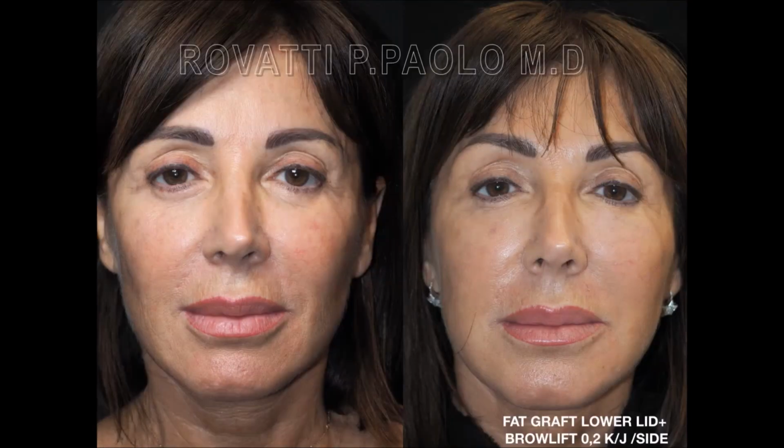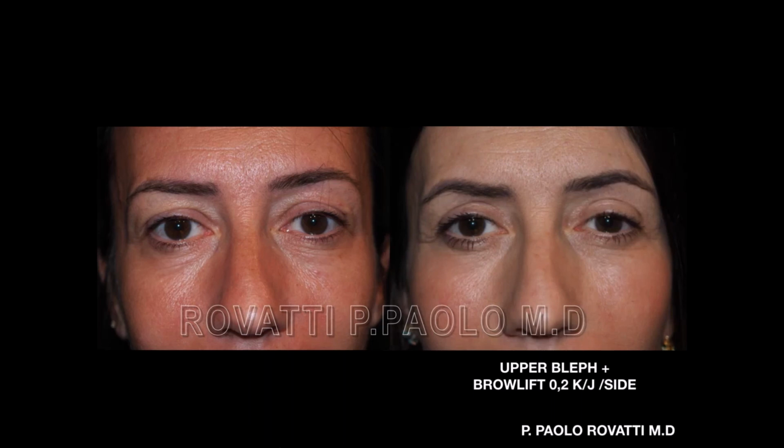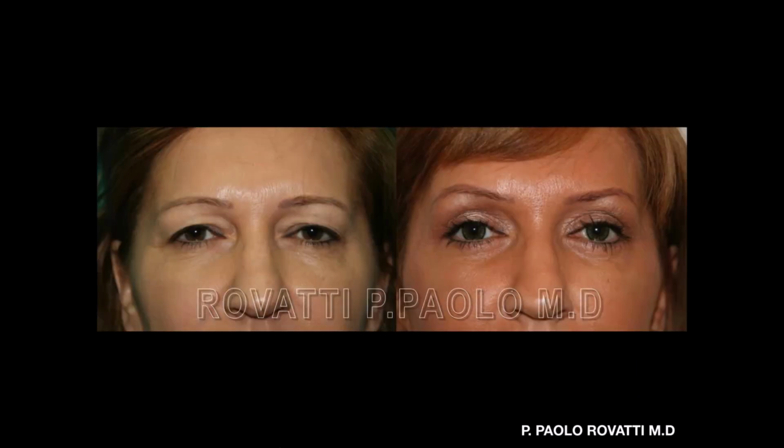And this one, just before, an upper blepharoplasty, I managed the upper blepharoplasty, and so they are flat brows, and I try to give an arch just to the lateral part of the brows. So after an upper blepharoplasty and a brow lift with an AccuTite 0.2, the results I think are good. And this again, and always the right is higher. Tell me why.